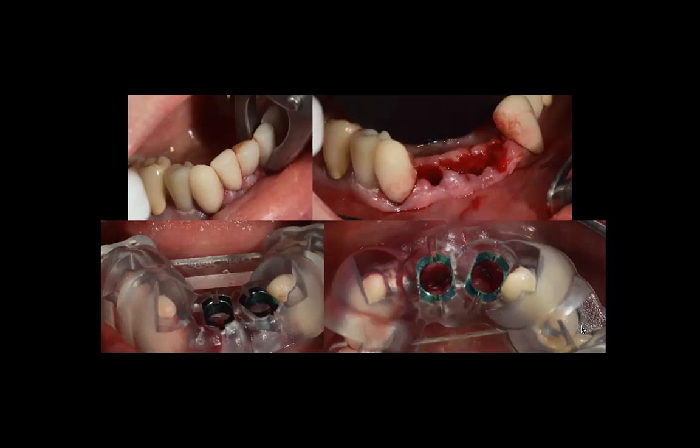And as far as the osteotomy is concerned, maybe you want to step back. If I'm placing a 13 millimeter, maybe I want to go with an 8 first. Take an x-ray. If you're starting this fresh, take an x-ray, verify your position first before you move on to your final length of your implant.